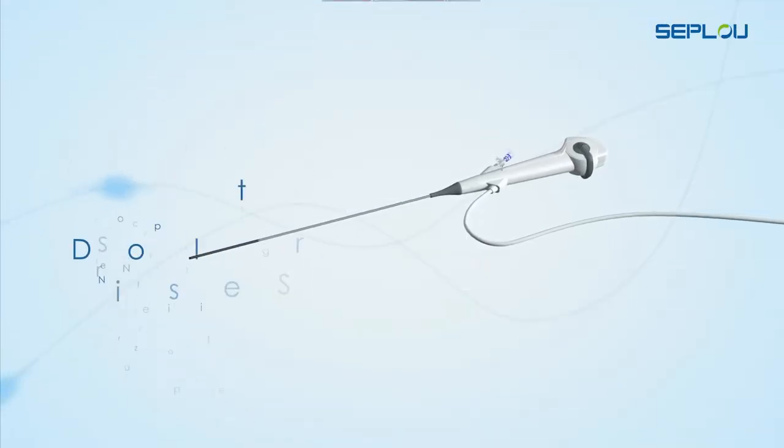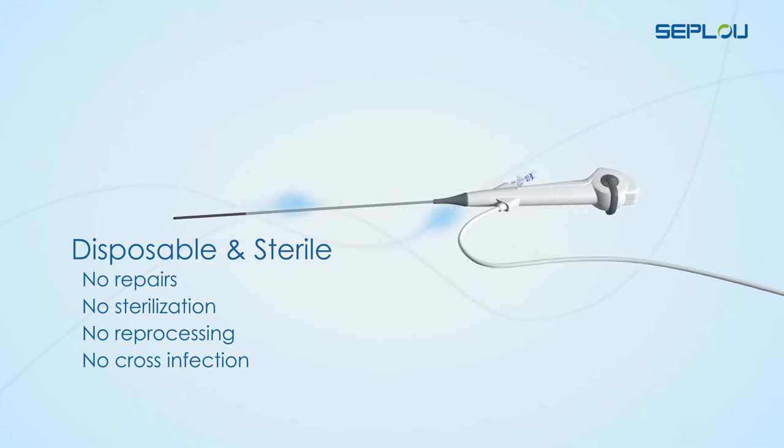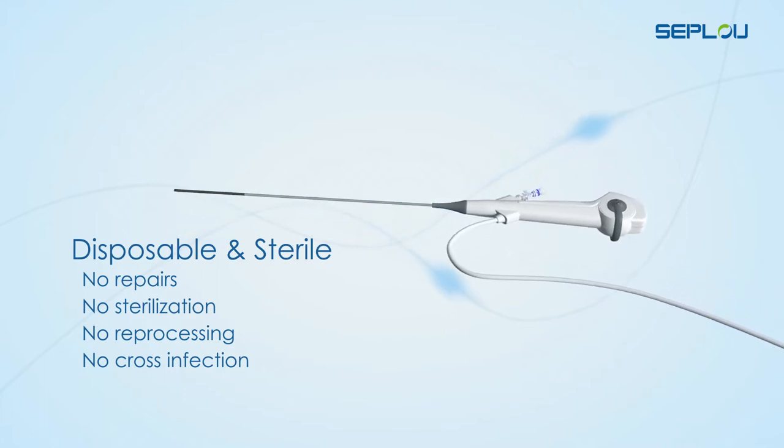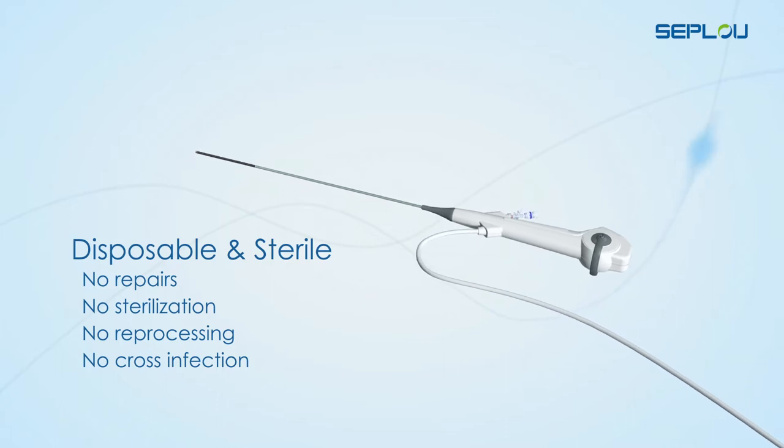The Seplu Single-Use Digital Flexible Ureteroscope — manage your cases as you always have, but with no repairs, no sterilization, no reprocessing, no cross-infection.